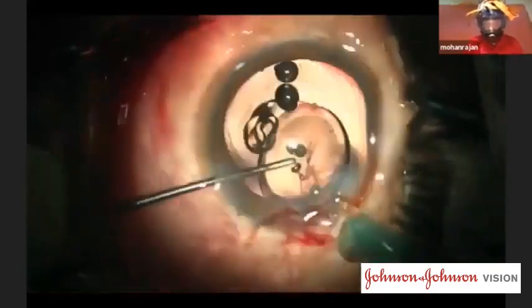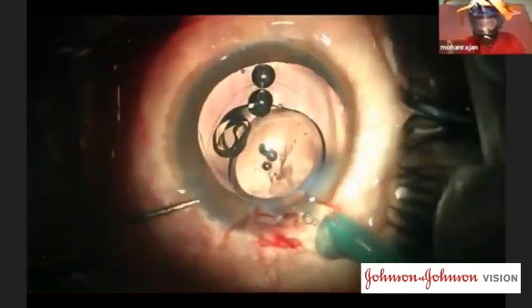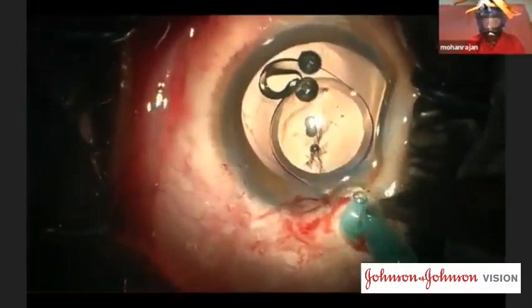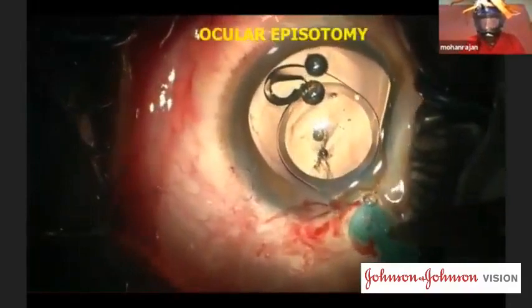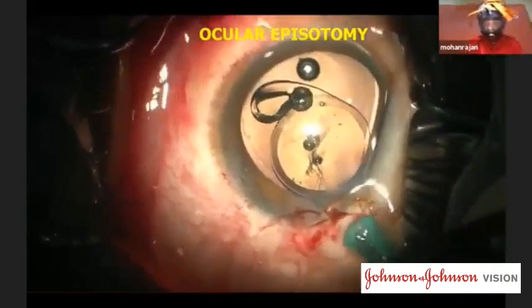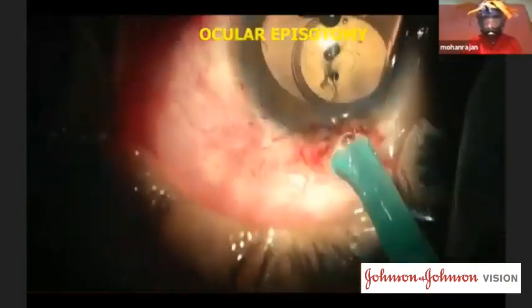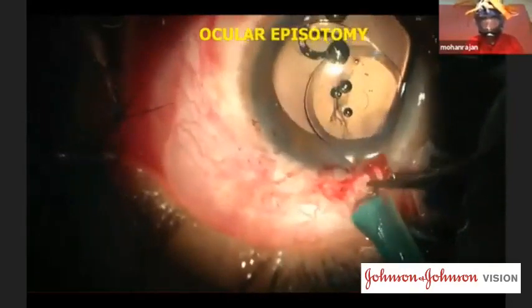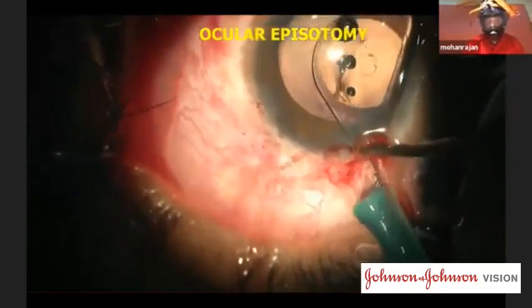So what is important is to take an 11 blade and do what is called an episiotomy. I call this ocular episiotomy. Open up the cartridge very nicely, and then you can release the haptic very beautifully without any problem, without any deformation of the haptic or anything like that. So this way you can save the lens and avoid an explantation.